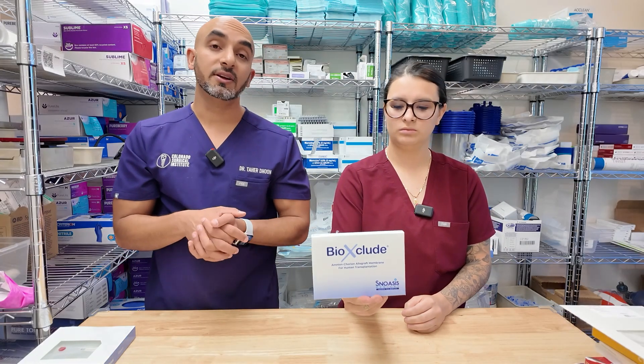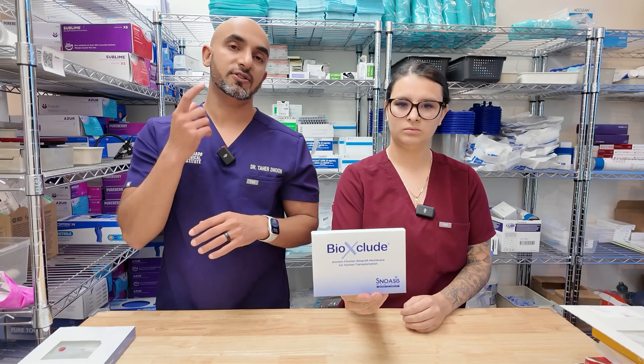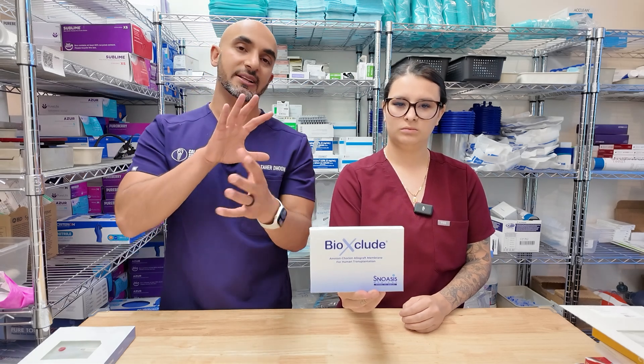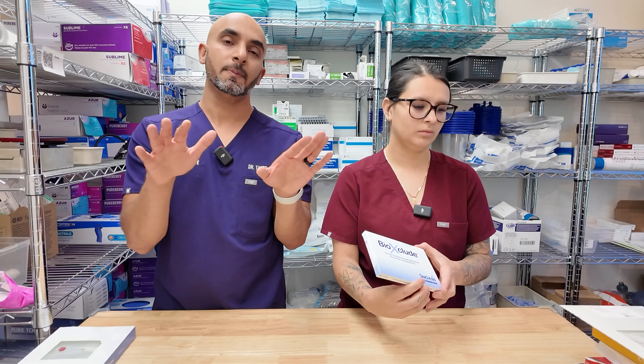BioExclude is really amazing stuff, but it's also insanely expensive. I like to use it if there's a tear over the sinus membrane — it patches that up really nicely. Or if I'm in a case where the patient has a lot of comorbidities and I'm really worried about them healing appropriately, I'll use it and suture over the top to really stimulate good tissue growth, because it's amniochorion. There are a lot of growth factors tied into this one and the body accepts it really, really nicely.